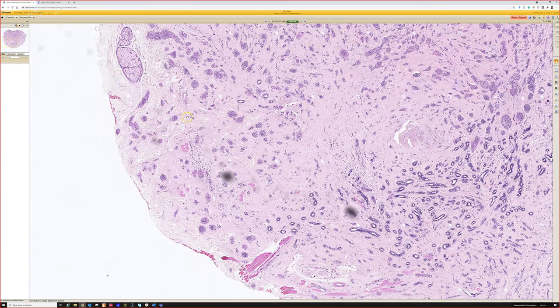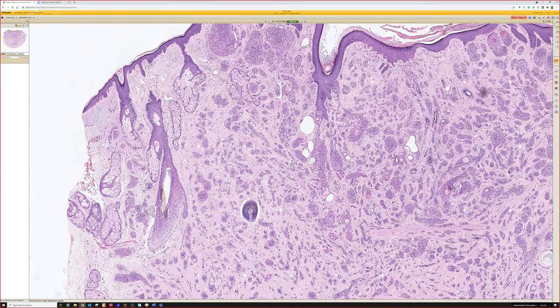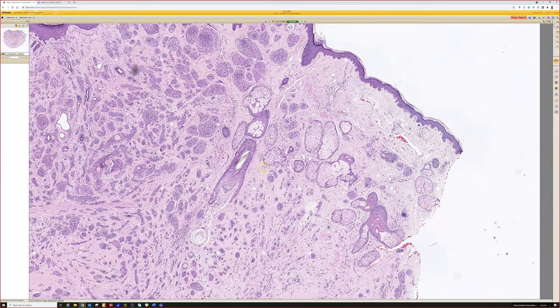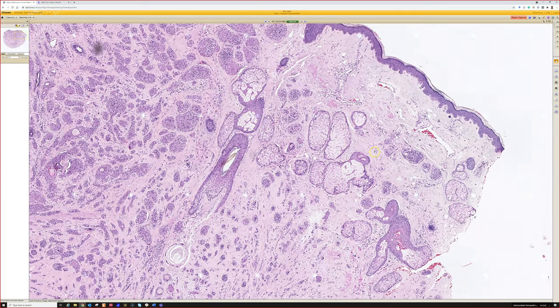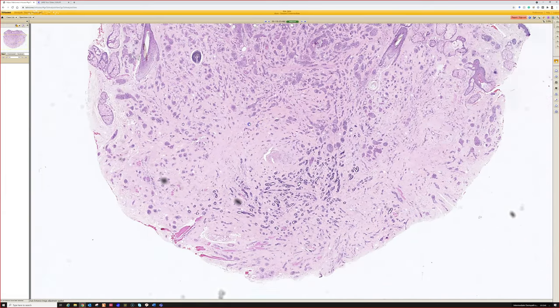They often have perineural invasion, but desmoplastic trichoeps can sometimes involve nerves also and still have an indolent course, which sounds crazy, but it's been nicely written about by the Yale group, and I've actually seen cases of it in practice too, and that had a good outcome as far as I'm aware. But so this is MAC, and pretty rare. I only see these maybe every few years, but unfortunately, a locally aggressive tumor.